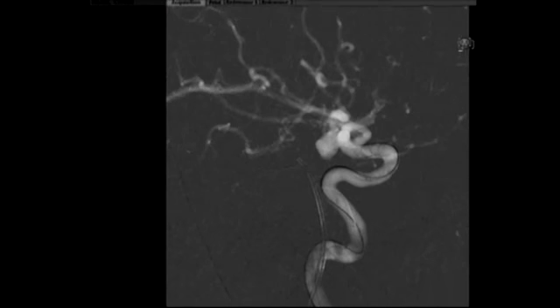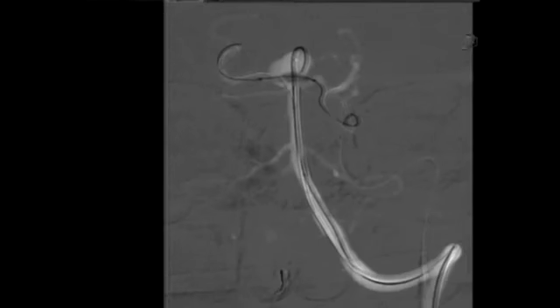We established another access, a secondary access, through the left femoral artery. A 6 French Envoy catheter was advanced into the left internal carotid artery, and after demonstrating adequate caliber of the posterior communicating artery, we navigated a HyperGlide balloon from the left internal carotid artery through the left posterior communicating artery into the left P1, P2 segment, spanning the neck of the aneurysm and landing the balloon covering the neck of the aneurysm into the right P1 segment. Note that at this point we proceed with the coiling.